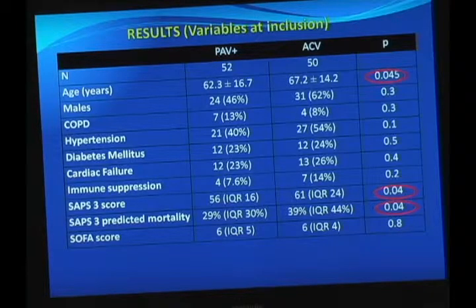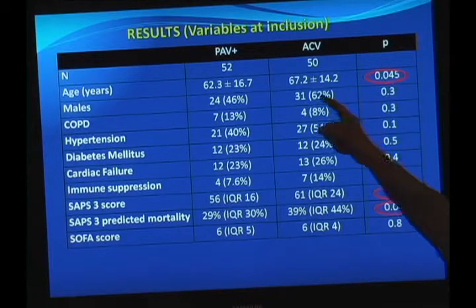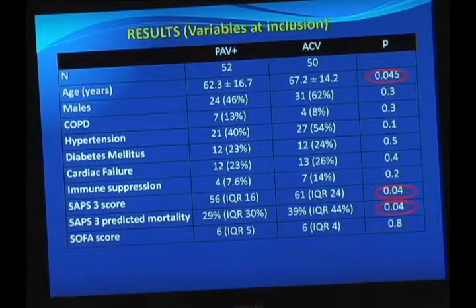And you have to know that in randomized studies something like this will happen: the age was not exactly the same, with a little bit older patients in the control mode. They also had a slow but significant increase in the SAPS-3 score that translates into an interesting increase in expected mortality from the very beginning. So, a little trouble from that.